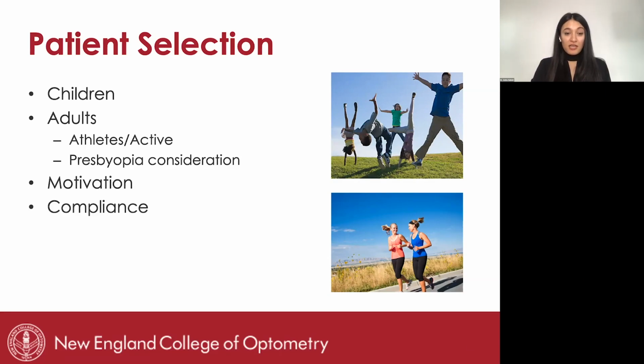Compliance in terms of cleaning the lenses I spoke about just now, it's really, really important with these nighttime lens wears that we're extremely vigilant about cleaning the lens, so that we're giving them the highest standard of safety. There have been reported cases of microbial keratitis with orthokeratology. So we have to make sure that we're ensuring that patients are cleaning their lenses properly and following our directions. Patients should also be made aware of these expectations about the cleaning.